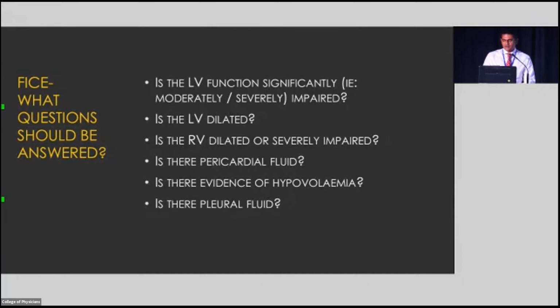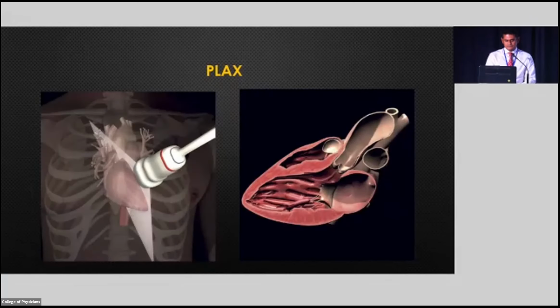So, parasternal long axis view. Imagine this is the view that you get with the parasternal long axis view. The probe pointer is towards the right clavicle, and you cut across the heart along this axis. You see the right ventricle closest to the probe, and you see the left ventricle, which is down here, the left atrium, mitral valve, LVOT, and then the aorta, the aortic valve.